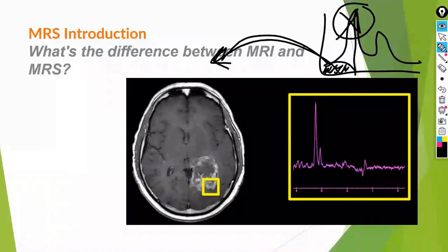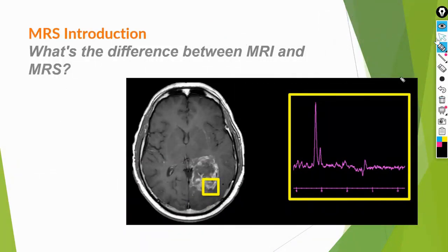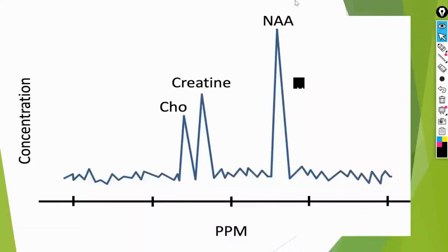Neurons, the nerve cells, contain a substance called N-acetylaspartate. Its curve is usually very large, or in normal conditions, it has this curve shape. So, N-acetylaspartate is the highest peak present. This is the normal shape. The concentrations of N-acetylaspartate, creatine, and choline are the three metabolites that give me a clear indication of my pathology, where its localization is, what type it is, and what its condition is.